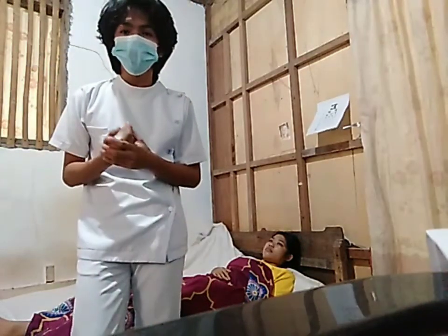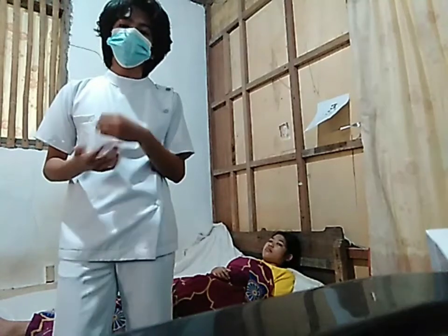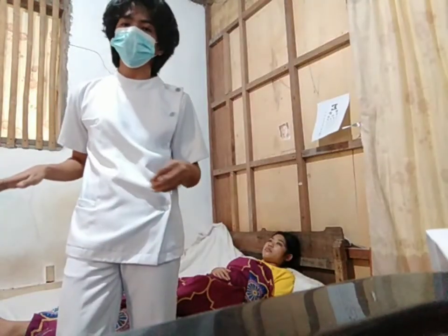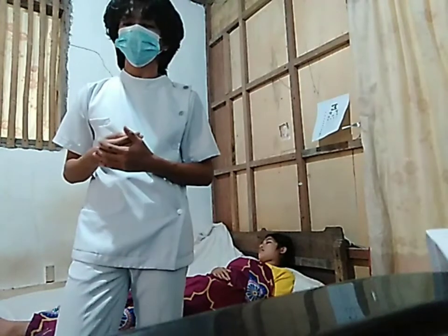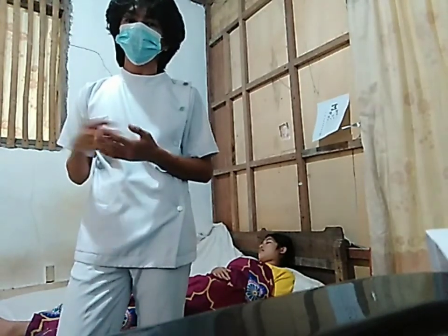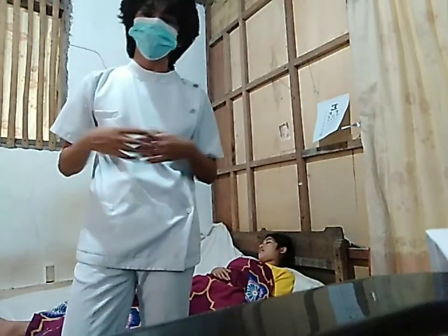So okay, I am now done with the hand hygiene, and I will now document everything: the amount of the solution, the length of the catheter, and the feeling of the patient during the insertion of the catheter. So okay, we are now done with the urinary catheterization. Thank you.